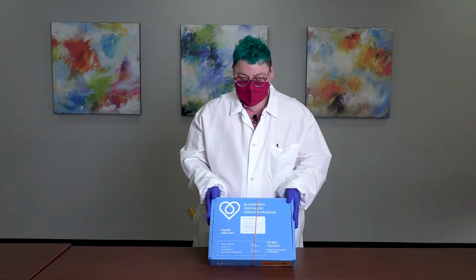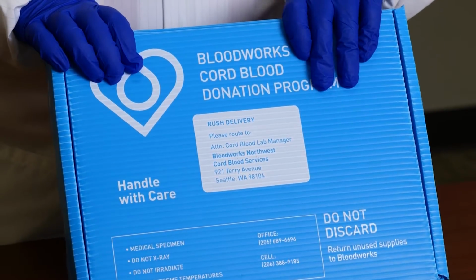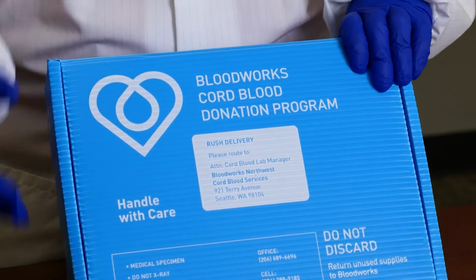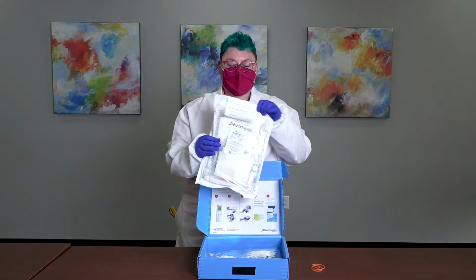Now we're going to go into the cord blood collection kit. For either a vaginal or cesarean delivery, you'll want to collect one of these kits. It includes packaging that will need to be returned to BloodWorks cord blood program for processing. Inside the box, we have the collection set.